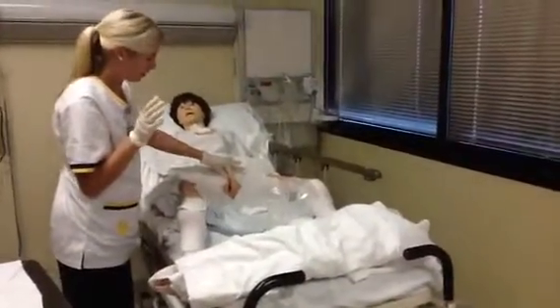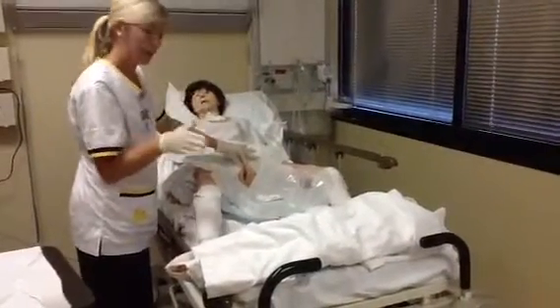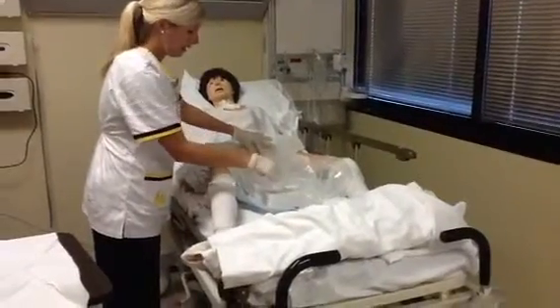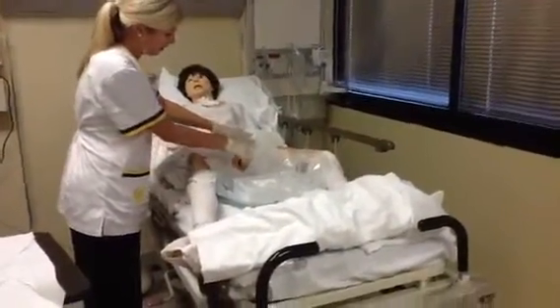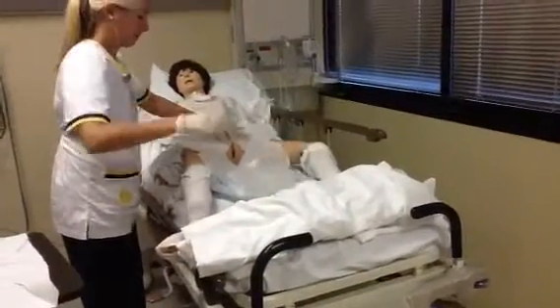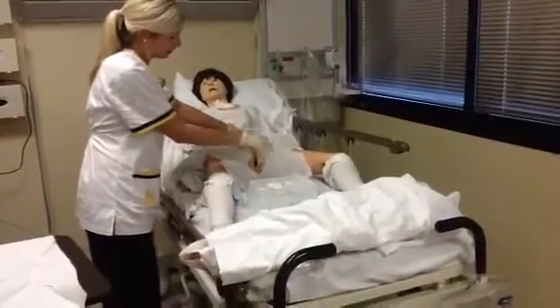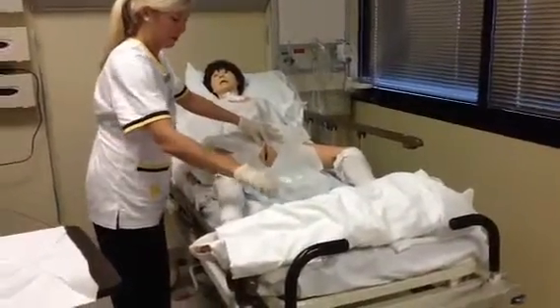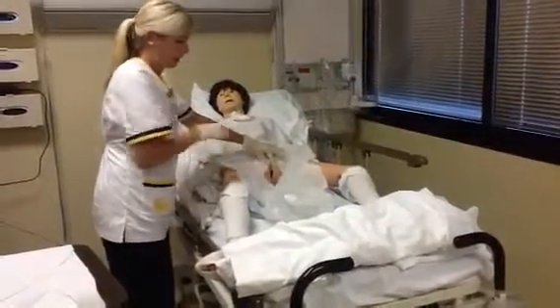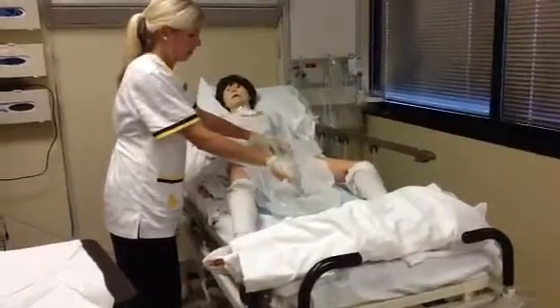So first, I'm going to clean the area, and I'm going to be cleaning from clitoris to anus. So I'll begin with my first one, and I'll be cleaning the outer labia first, clitoris to anus, coming around my field, making sure not to reach over. Then I will take the next one and do the inner, coming around, placing it in, coming back again, doing the middle, coming around, throwing it away, making sure not to contaminate anything.